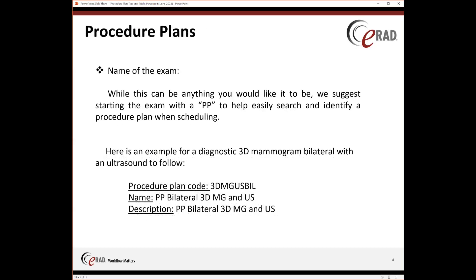For the example shown, it is set up as procedure code '3D MAMMO Ultrasound Bilateral' with a name of 'PP Bilateral 3D MAMMO and Ultrasound' and a description to match. That's just a pretty easy naming guideline. You also want your procedure code plans to make sense so that they're easily identifiable.